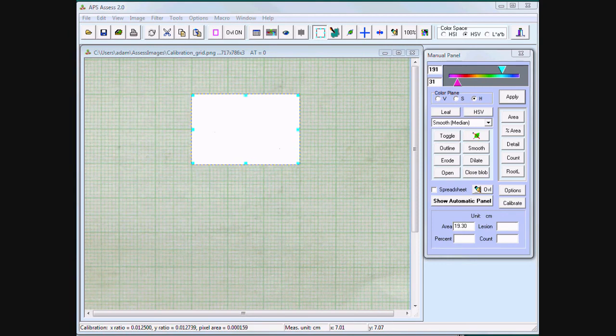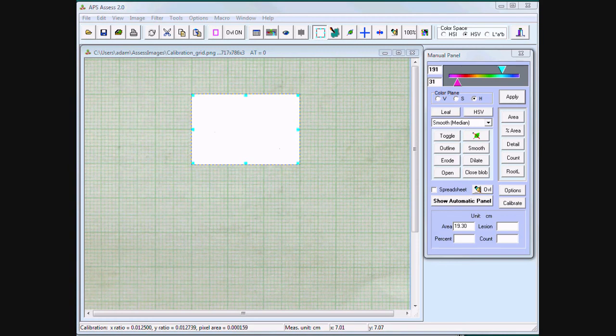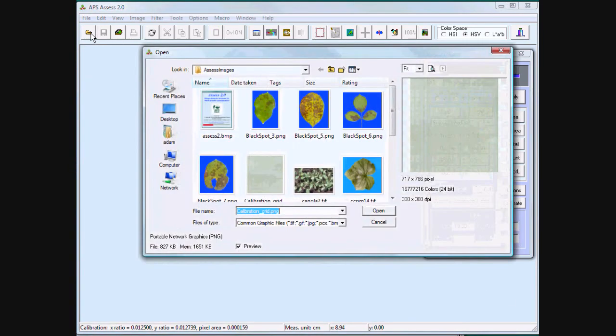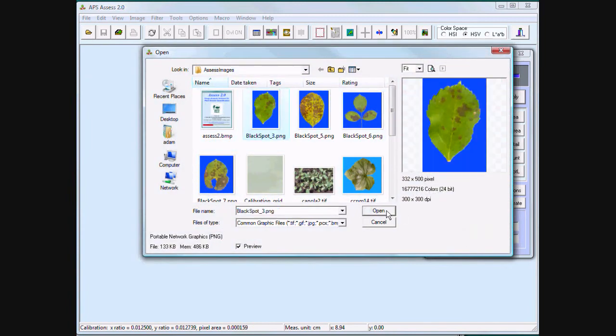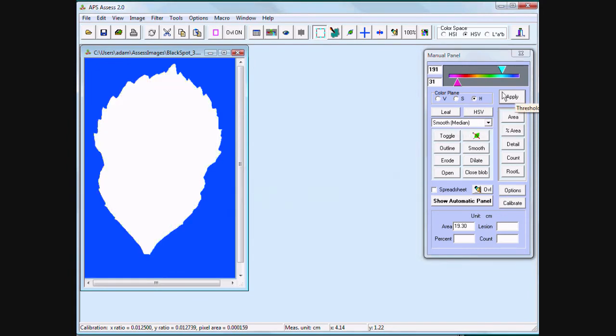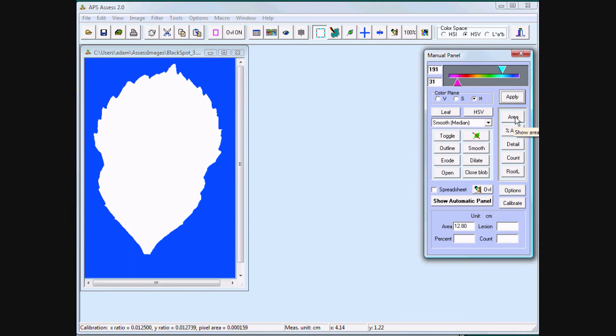Once Assess has been calibrated, you can use it as a simple and easy leaf area meter. Threshold the leaf, press area. 12.8 centimeters.